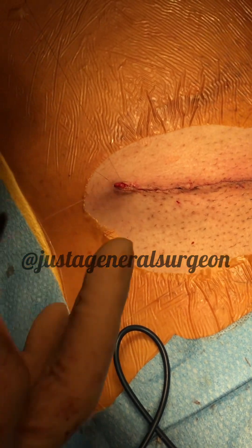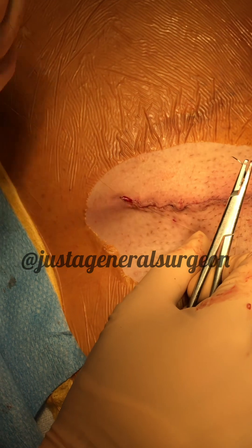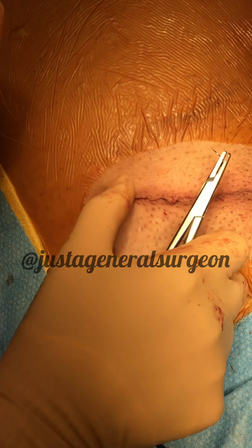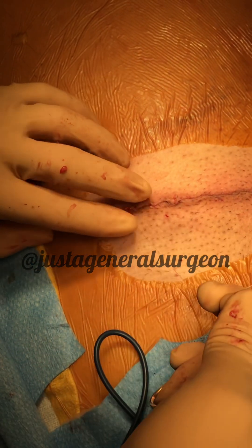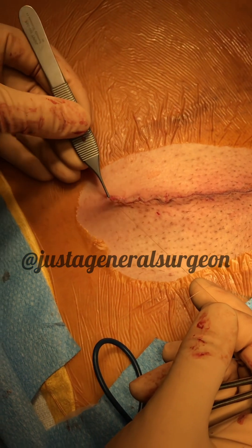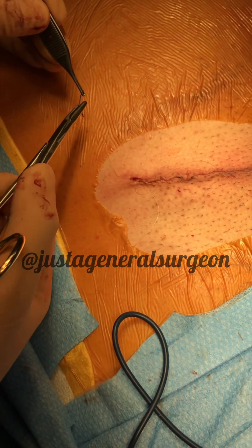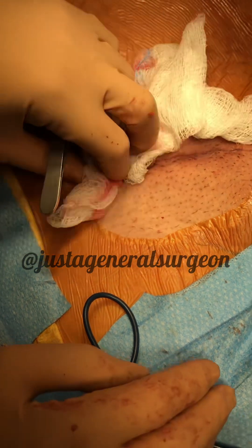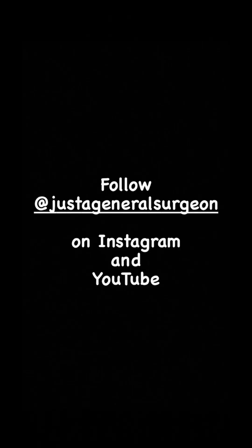To finish the subcuticular stitch, we put a little loop and bring the loop three times to form a knot. Bring the needle through the loop one more time to secure and lock the knot. Then bury the knot by going at the corner without cutting the stitch and bringing it out through the skin. That's your subcuticular closure, and I put dermal bond on it.